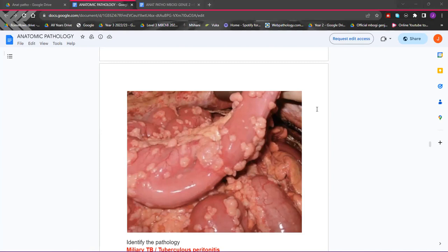These nodules appear, yeah, they also appear large and raised. I agree. Also, maybe someone can say small. So I guess size is relative. They look millet-like. I might disagree, but yeah, maybe. I'm not 100% sure on millet-like. But we've said that they look nodular, right? And size, give or take, they're large or small. Do they extend to the adjacent tissue? Are they solid? Maybe those are some of the questions you can ask.